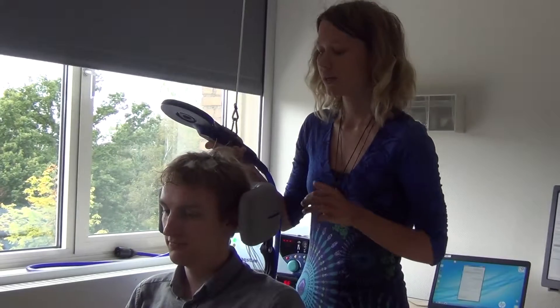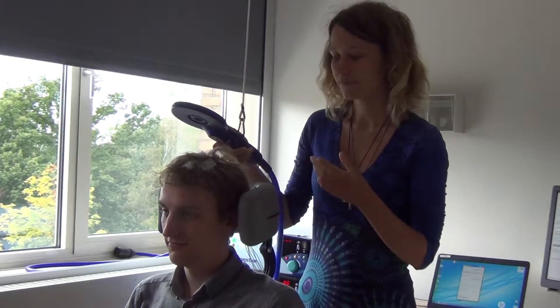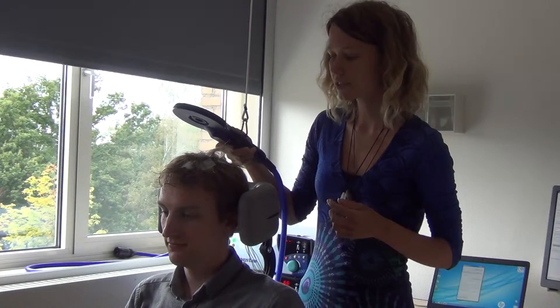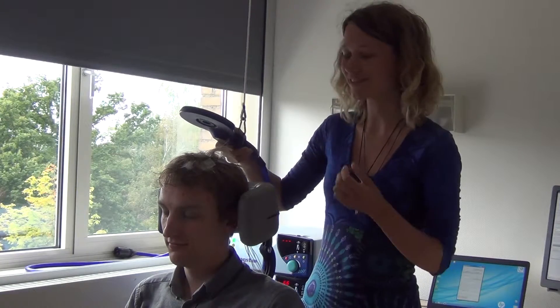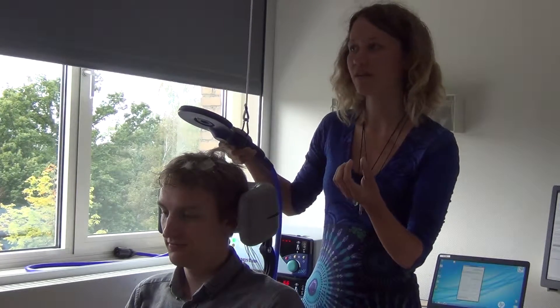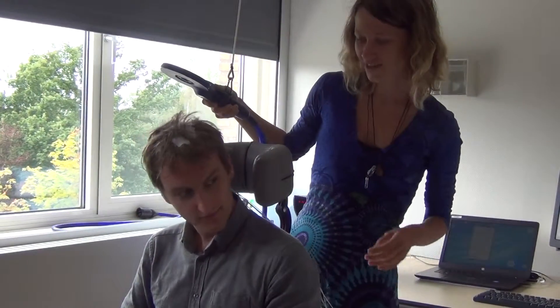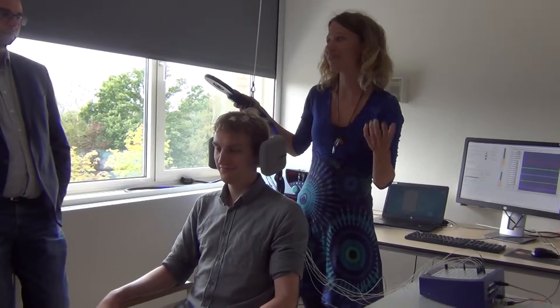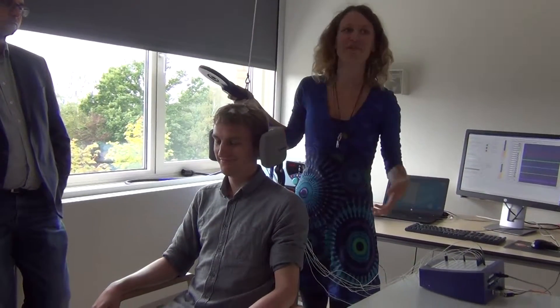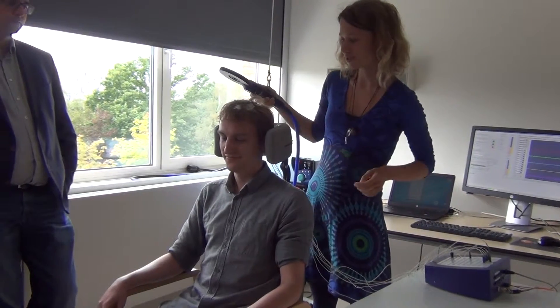If you do it at the right spot, you can get a current in the motor cortex, and if you get a current at the right spot in the motor cortex, you get a movement in the thumb. We also made this headrest on the chair because subjects — if they hear something they look at it — so therefore we made this so that people understand they need to hold their heads still.